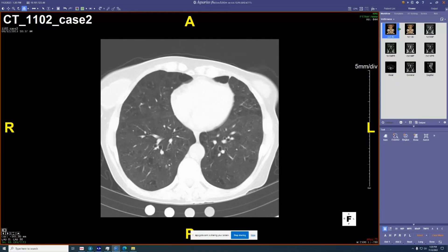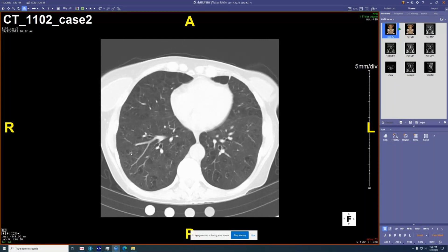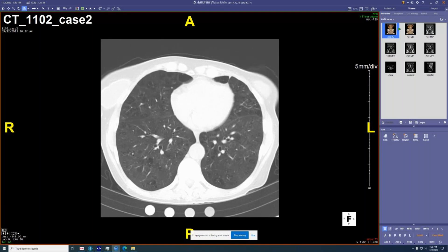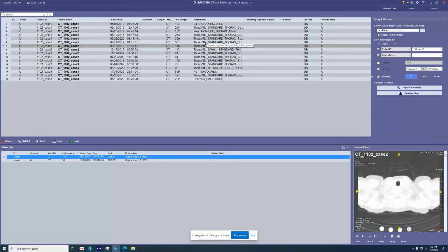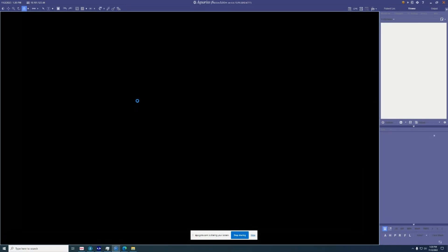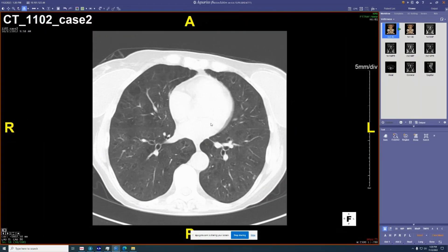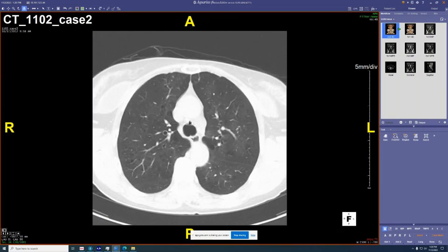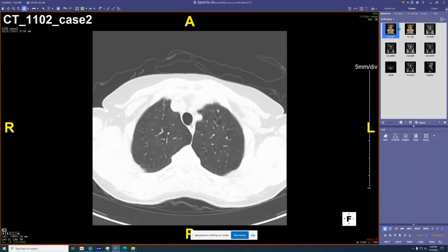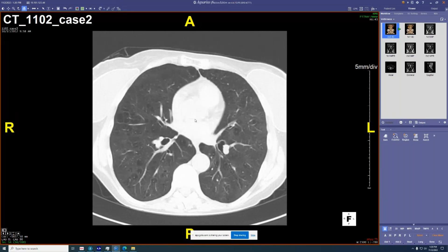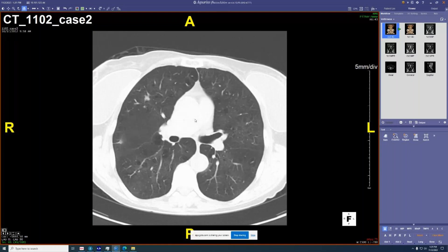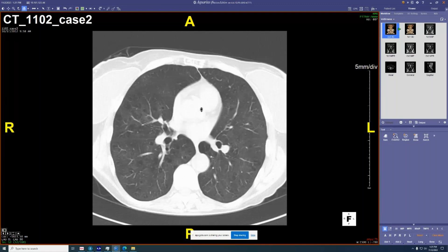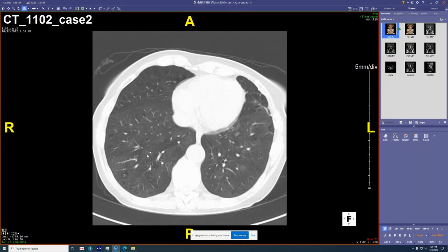We've seen a fair number of cases of never-smokers where the areas of emphysema line the peribronchovascular interstitium — you can see it in the right lower lobe lateral and anterior segments. We have about six or seven cases exactly like this, unfortunately all ANCA-positive or MPO-positive never-smokers with lower-lobe emphysema in a peribronchovascular distribution. We just don't have pathology on any of it, so it's hard to write up.